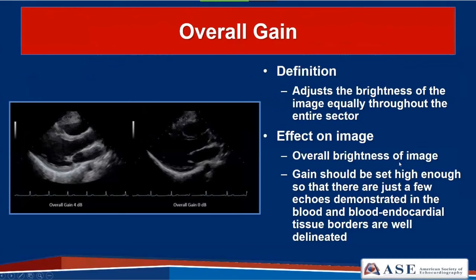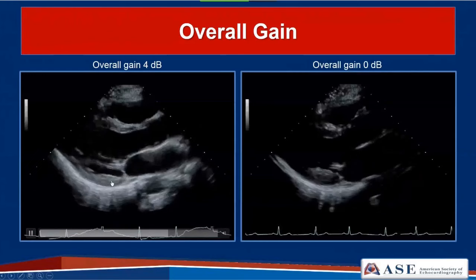Next, overall gain is an instrumentation control that adjusts the brightness of the image equally throughout the entire sector. The gain should be set just high enough so that there are just a few echoes demonstrated in the blood, and the blood-endocardial tissue borders are well delineated. This is an appropriately gained image at 4 decibels compared to an undergained image, where you see the loss of detail in discerning blood-endocardial tissue borders.